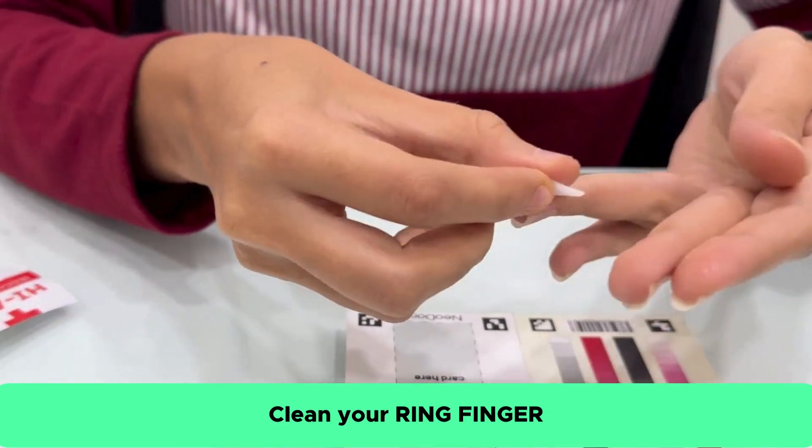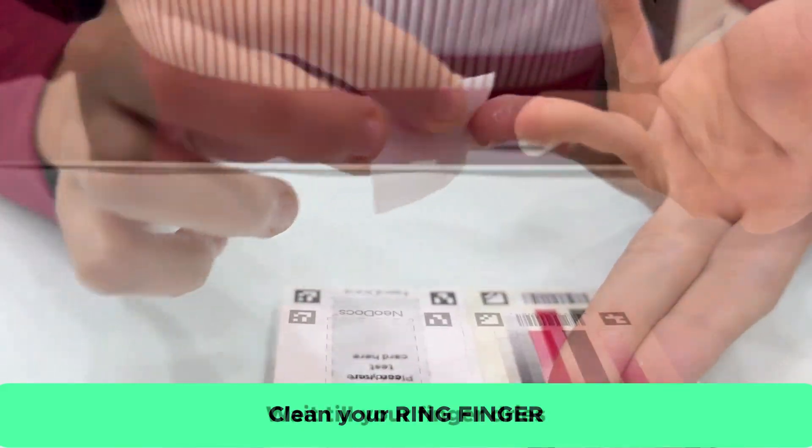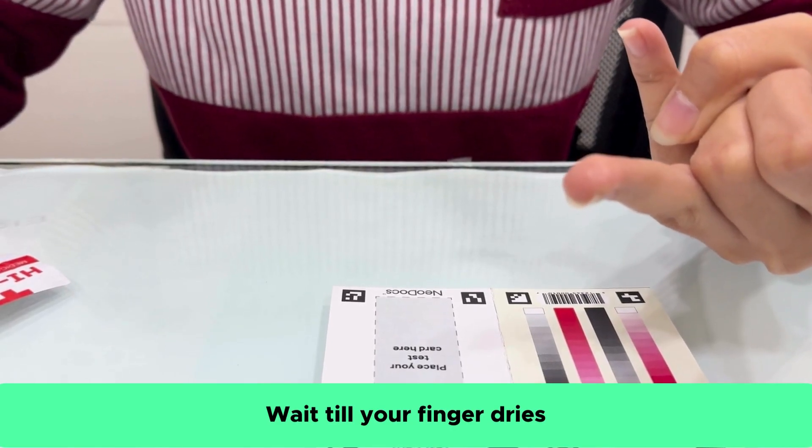Clean the ring finger of your non-dominant hand with the given alcohol swab. Wait for the finger to dry out naturally.